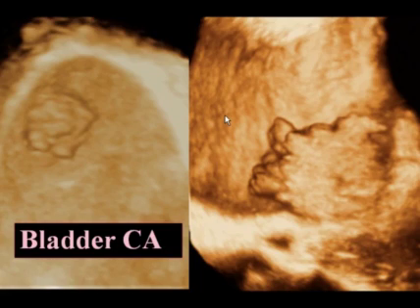When you are scanning the pelvis, remember that you also can take a look at the bladder. And in this case, these are two different cases. We have a lesion in the bladder right here and right here, which is irregular and very sessile in appearance, and these are bladder carcinomas.